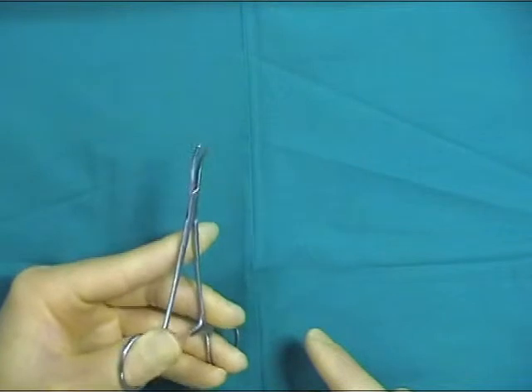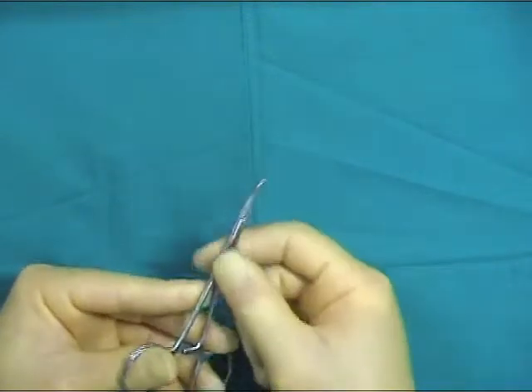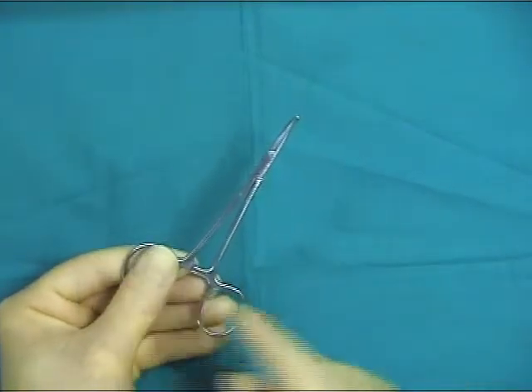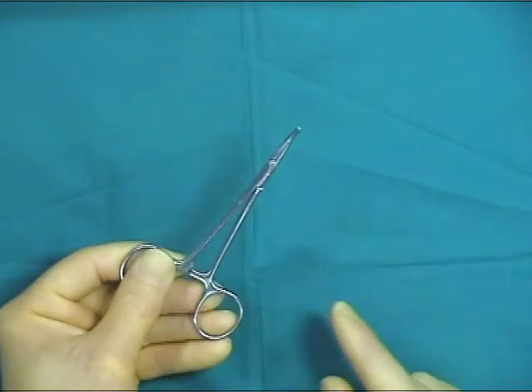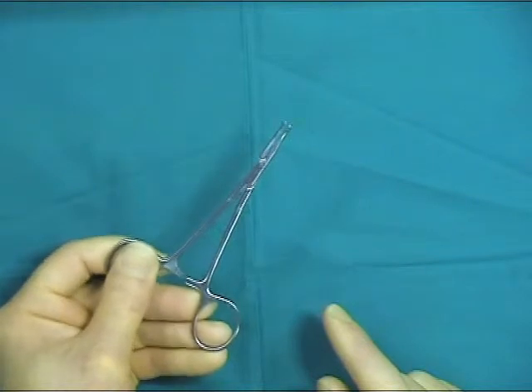If you cannot master pulling the thumb towards the hand, the alternative way is to use the open palm technique, utilising the thumb and index finger on one loop of the hemostat and the middle and ring fingers on the other loop, opening the hemostat like this.